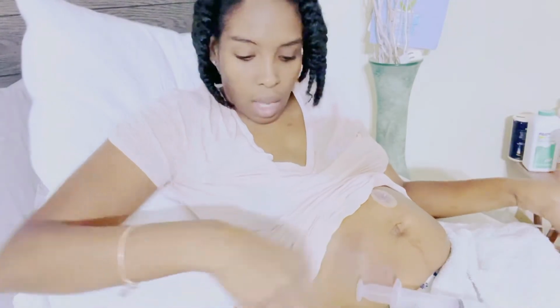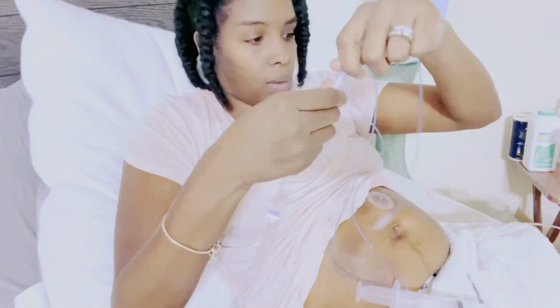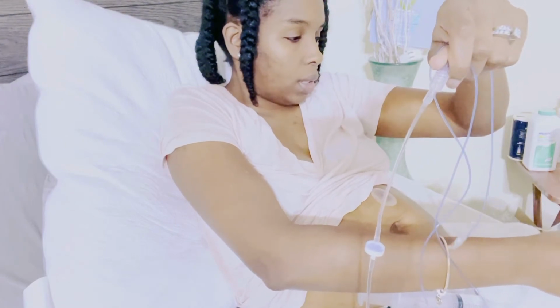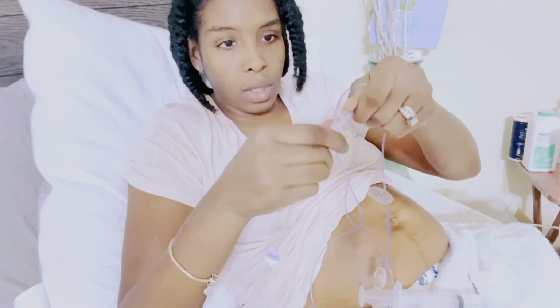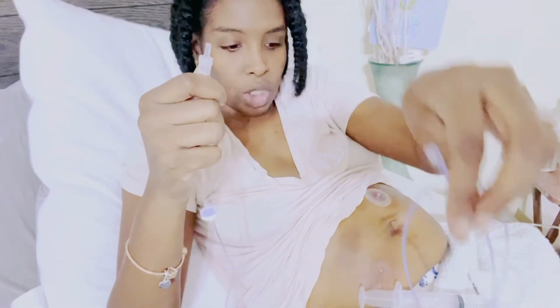Okay, so now that we're done with that, I'm going to take this piece, the blue piece, off of the tubing right here. Hold on. Okay, I hear you. Hold on one second. It's saying I left it unattended. It's too long. So now I'm going to just undo that. See? Take that loose. This is trash. Put that in my little trash pile.